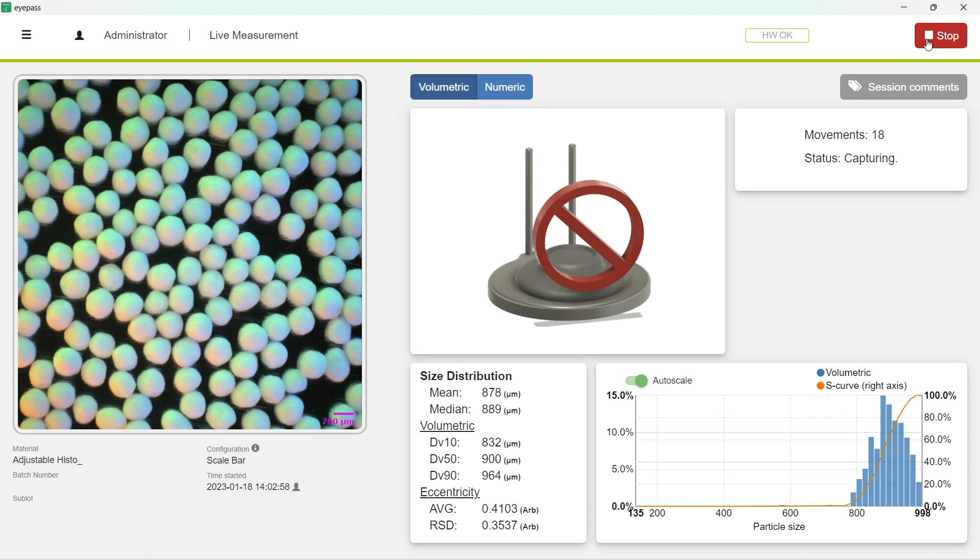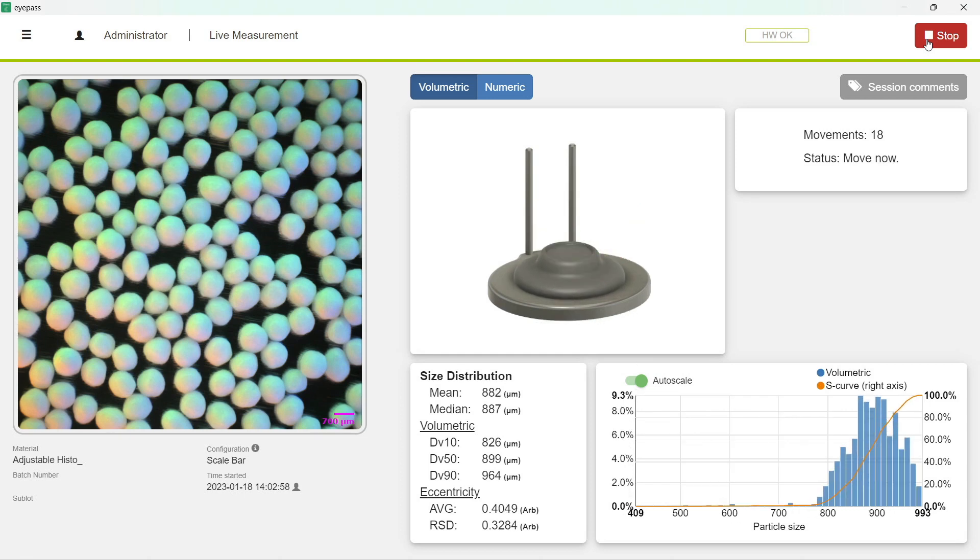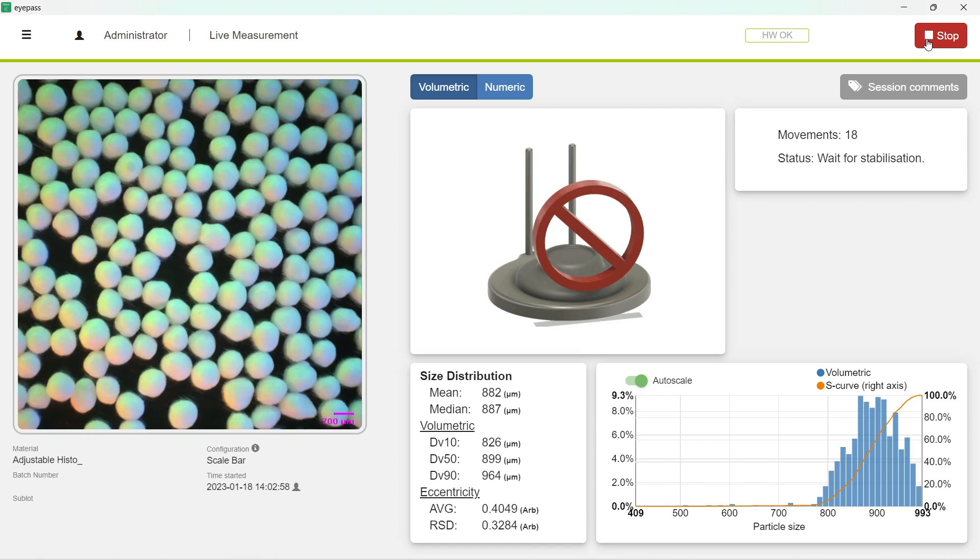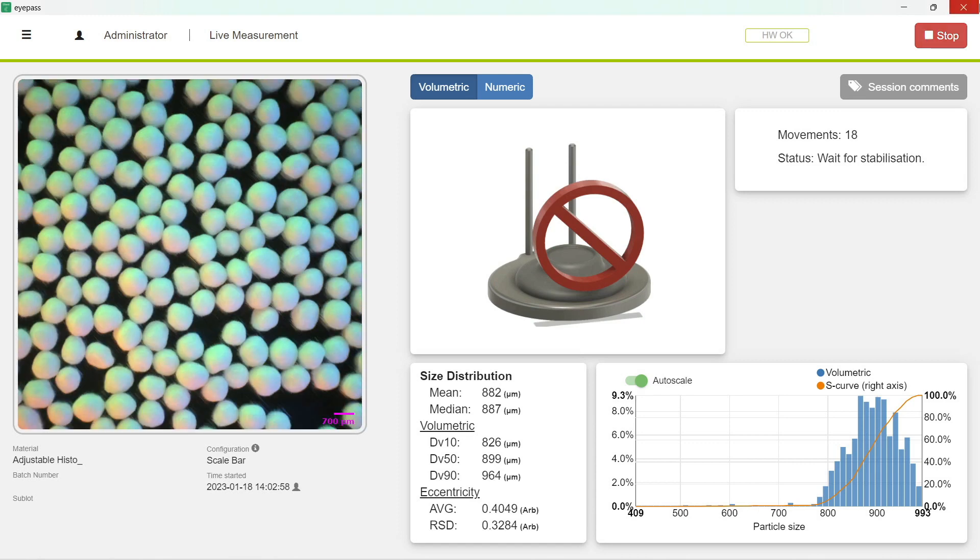This is what a benchtop session looks like, and we are going to talk about the new feature called adjustable histogram. Essentially, it adjusts the graphical representation range of your particle size distribution.